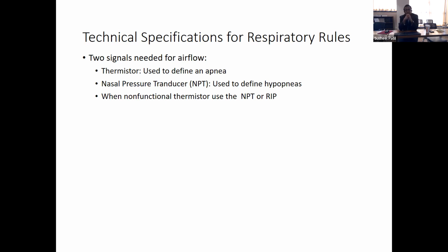There are ways to linearize the nasal pressure transducer from a biosignaling standpoint, and in fact, our system can do that. But this is a subject where I'm not going to dive deep. I strongly recommend, and I'll try to find a couple of papers for you, that you sit and try to understand the differences between thermistor technology and nasal pressure transducer technology, so you understand the positives and the negatives of both.